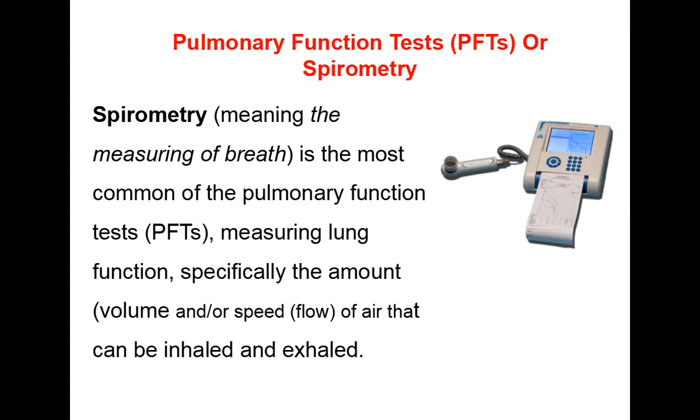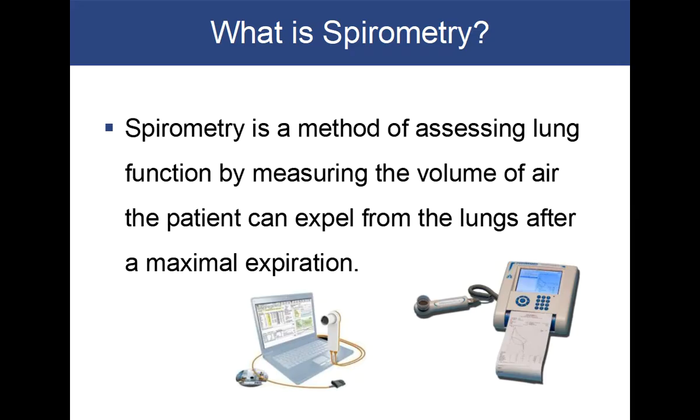So, the pulmonary function test or spirometry, spirometry meaning the measuring of breath, is the most common pulmonary function test, measuring lung function, specifically the amount, the volume, and the speed of the air that can be inhaled or exhaled. Spirometry is a method of assessing lung function by measuring the volume of air the patient can expel from the lungs after a maximal expiration.